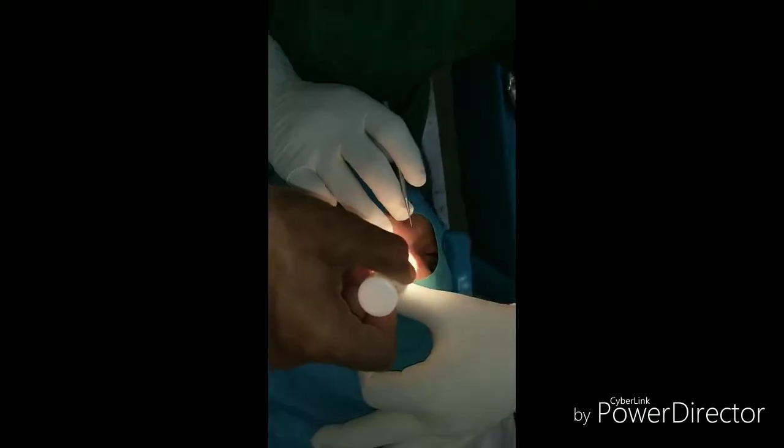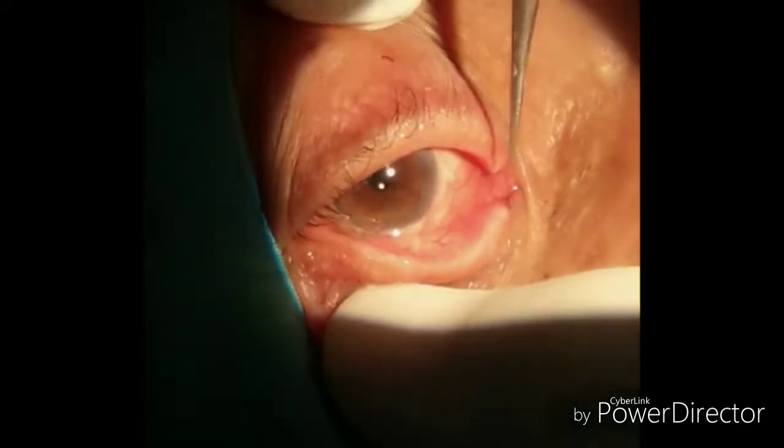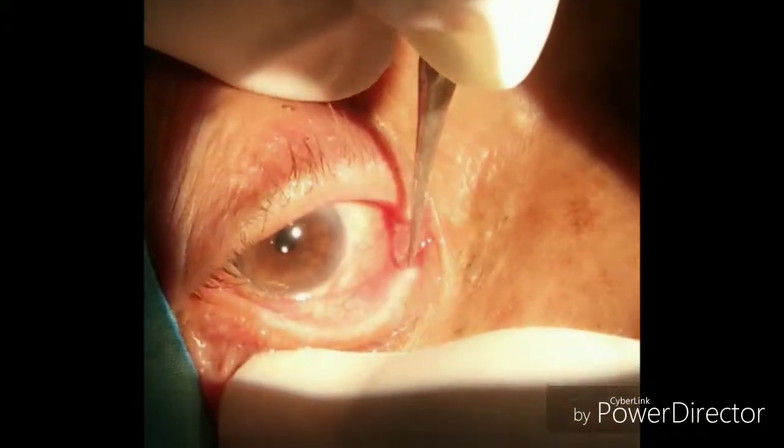Hi, I am Dr. Sarjil, and today I would like to demonstrate how to do probing and syringing in a case of persistent watering. Here we have a very old patient. I am doing the regurgitation test of the right eye and now the left eye. In the regurgitation test, you press the medial canthus, and if there is nasolacrimal duct obstruction, mucopurulent discharge comes out.